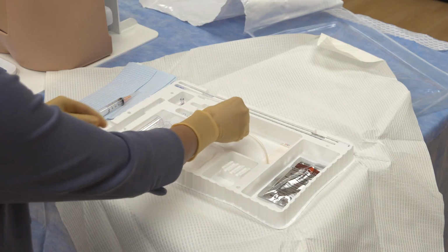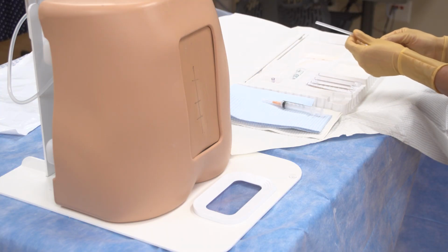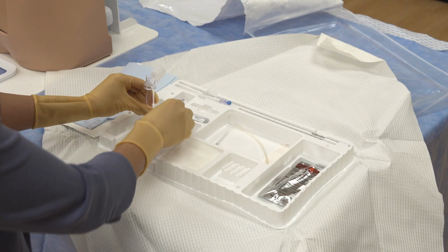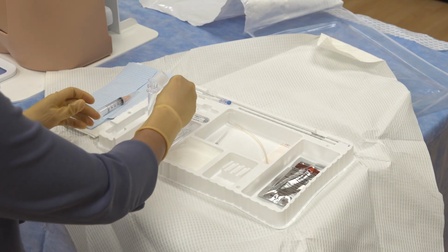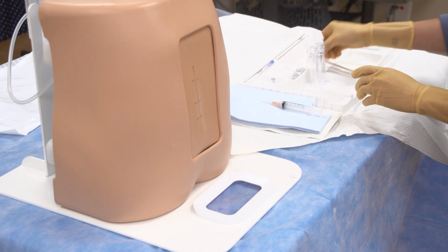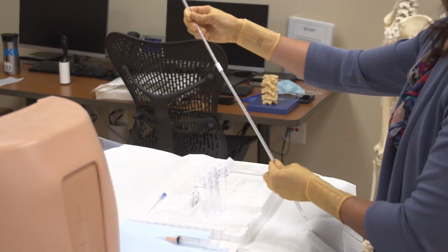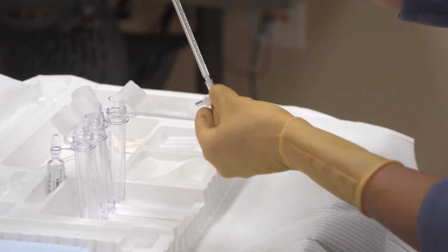The most common spinal needle included in kits used by internists are the 9 centimeter Quincke tips. Other lengths and types of needles can be used for this procedure depending on your pre-procedural map depth. You'll also find 4 collection tubes, which should be open and set upright for easy access. Arrange the tubes in sequential order as they are pre-labeled as such. You'll also find a vial of lidocaine, gauze, and betadine swabs, and a fenestrated drape and sterile field disposable towel. Prepare the 3-part manometer if opening pressure is desired. Adjust the stopcock so the flow will be directed to the manometer upon connection to the spinal needle.